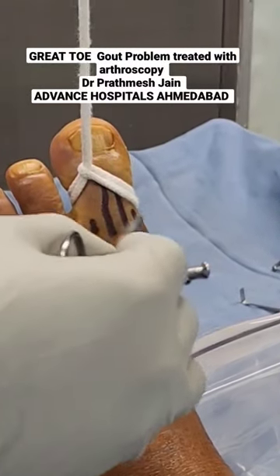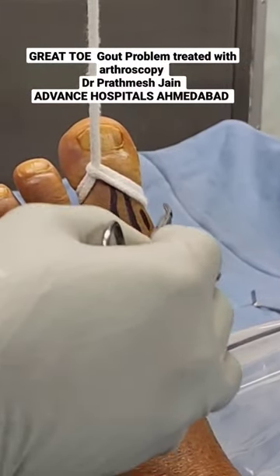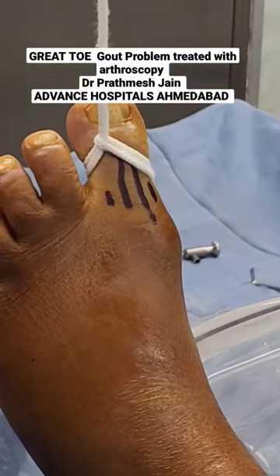We will be taking care to avoid dorsal cutaneous nerves while making this portal by just making small nicks.